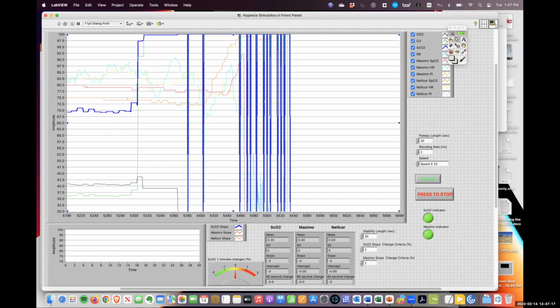This is biological data. It is noisy. It is more challenging. It has errors, and even if the gold standard is maybe only a silver standard, it's still probably much closer to the real value than certainly the pulse oximeter. But there are certain real issues trying to get good human data.